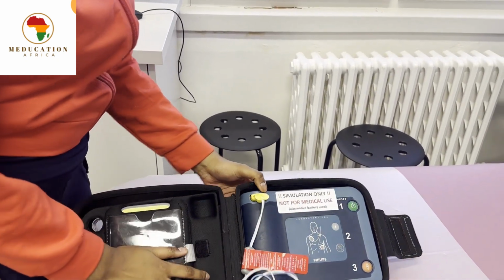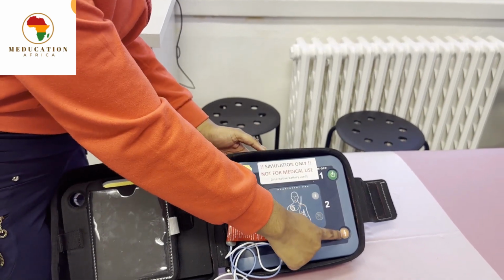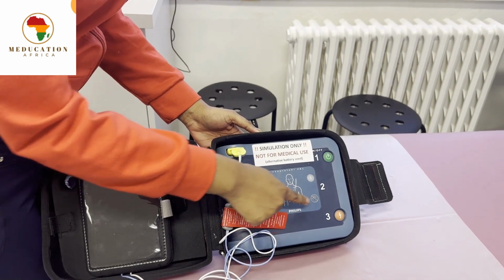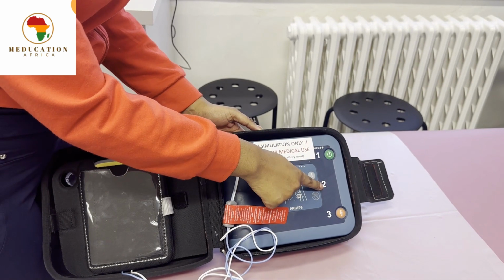This is the defibrillator. It has a power button shown in green here and a shock button. This is the button you press to apply the shock. The button will blink when the shock should be applied, and the AED will tell you to apply the shock. Again, there is an image showing where the pads should be placed on the person. There is also a warning light. When this light is blinking, it means that you shouldn't touch the person. So again, power, warning, shock.